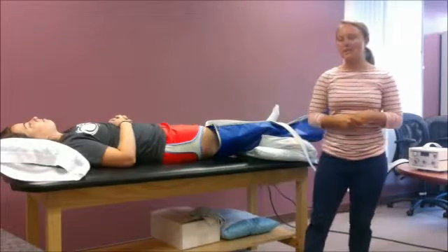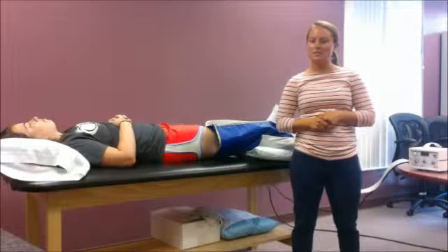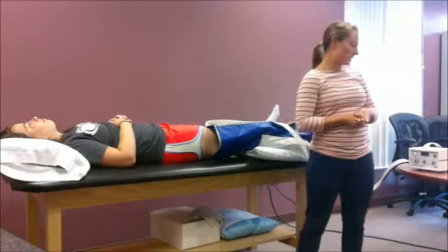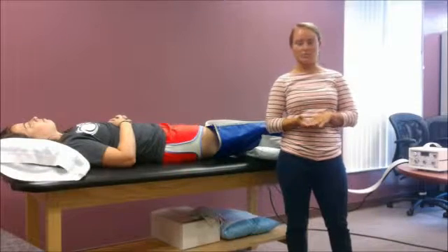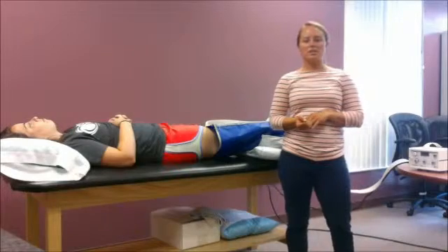The parameters for this treatment are going to be 40 to 80 millimeters of mercury for pressure. I'm going to start at 60 and then we can adjust it as we go. The inflation time is going to be 90 seconds and the deflation time is going to be 30 seconds, since it needs to be a 3 to 1 ratio. The total treatment time is going to be 2 to 3 hours.